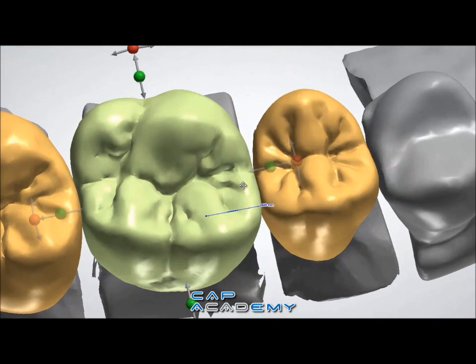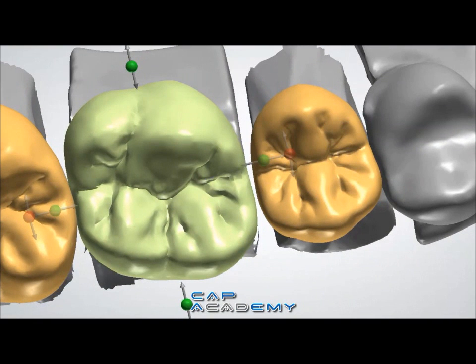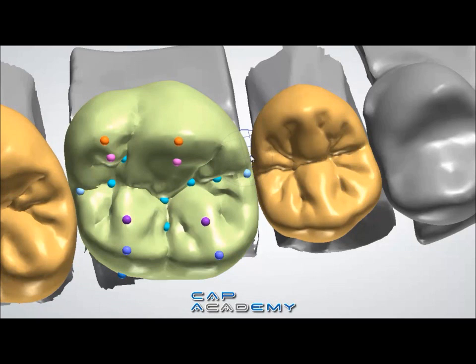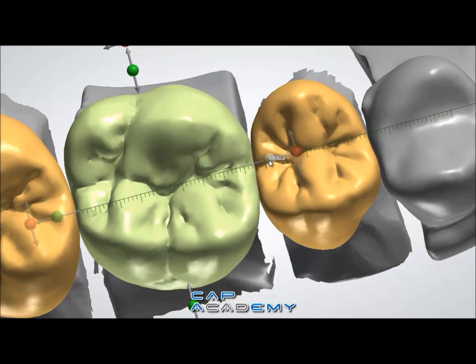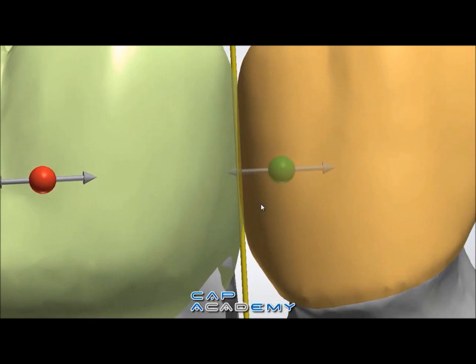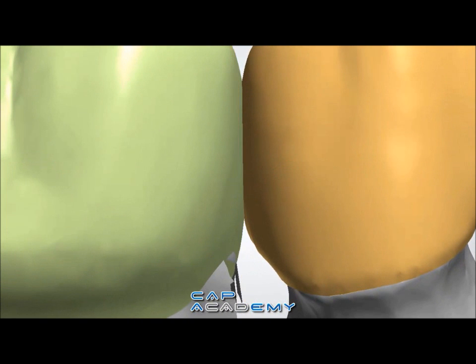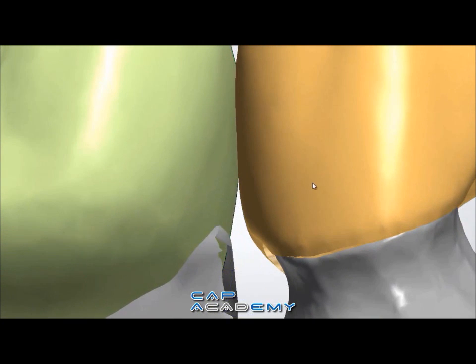The way the bridge connectors work with full contour, with none as a bridge connector, is it's done through intersection — through having them collide and crossing through each other. So right here I'm just fixing my contact, and then I'm using the transform tool and pulling it out. Now you see I have a nice intersection on the two restorations, the pontic and the prep, and you can do a little tweaking.